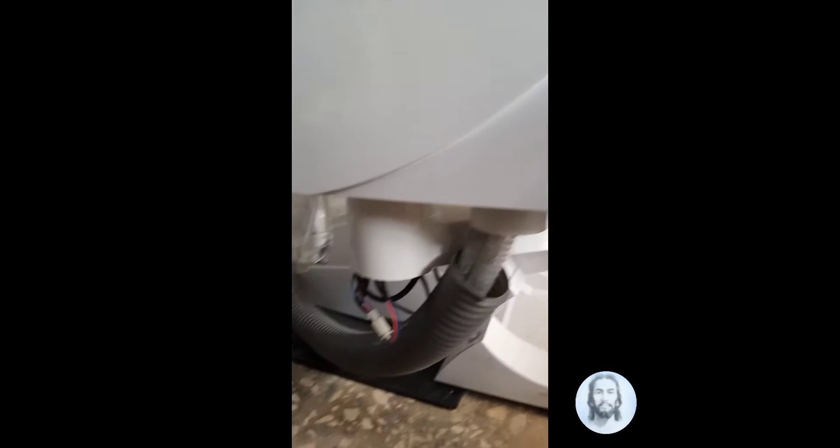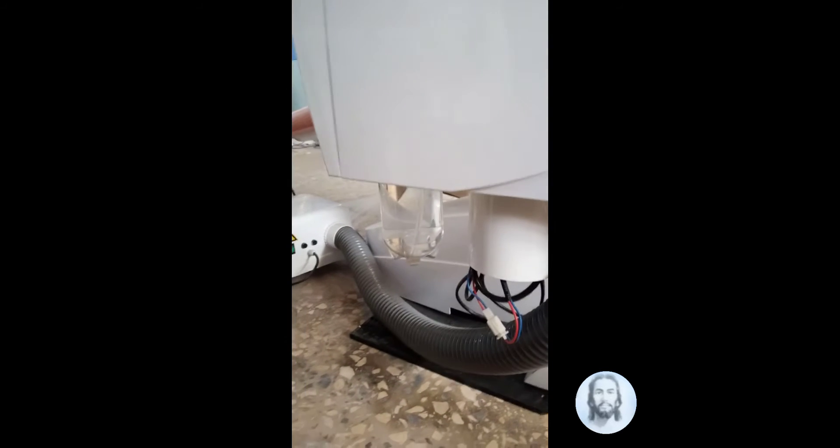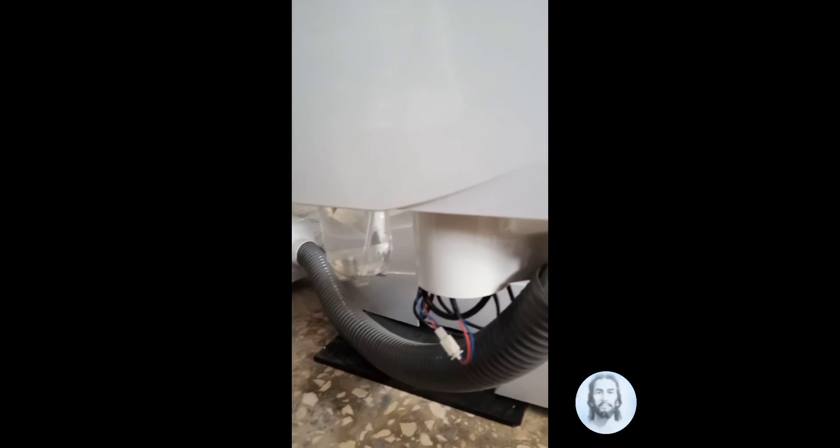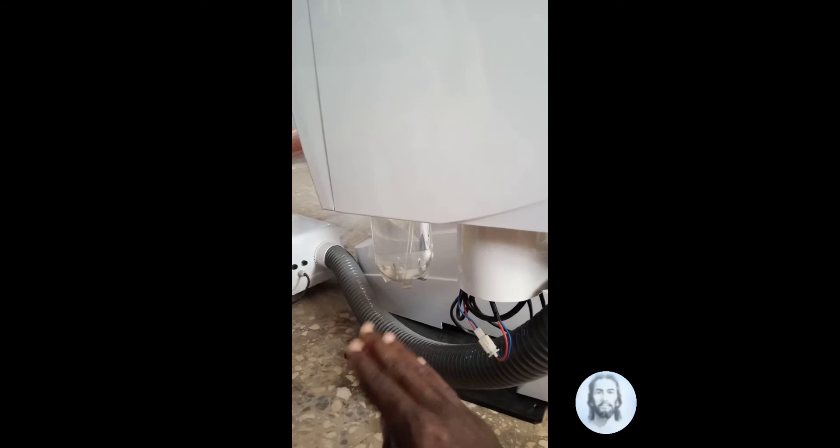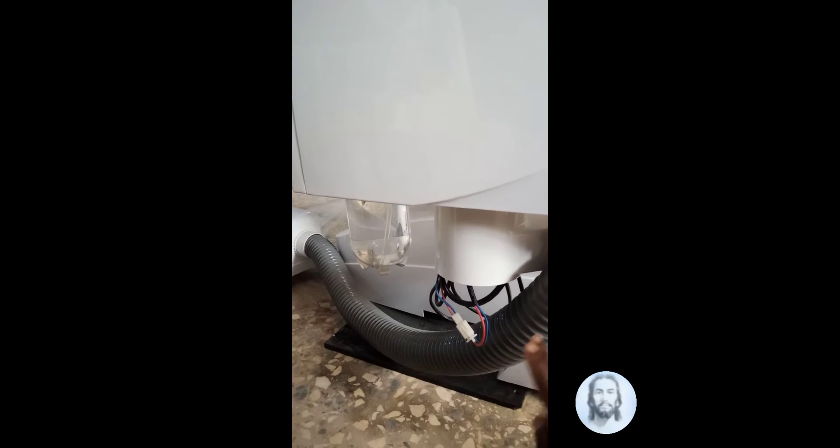Over here is the water reservoir. When the water is done, it flows out one way, and air comes through the other way.